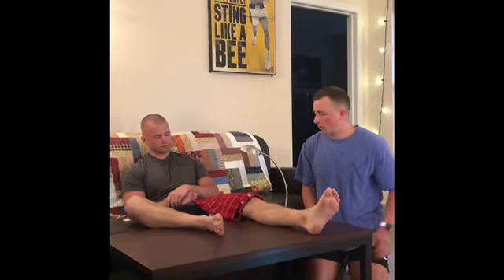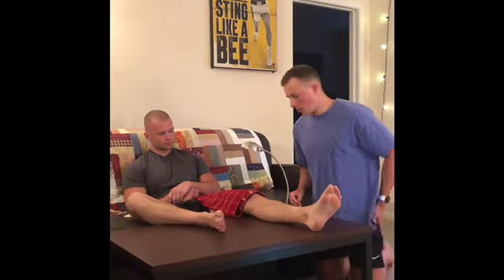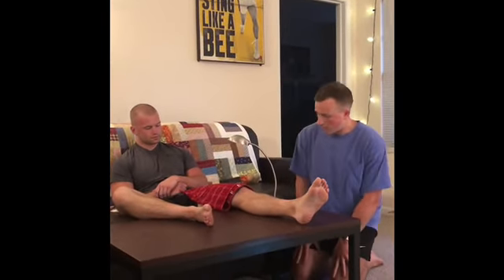So Logan, we're going to be using this device here to heat up your thigh, and then we're going to get you up and stretch you afterwards. This would be the time that we screen for any contraindications and precautions that I mentioned earlier. So if those are all clear, we'll set up the diathermy.